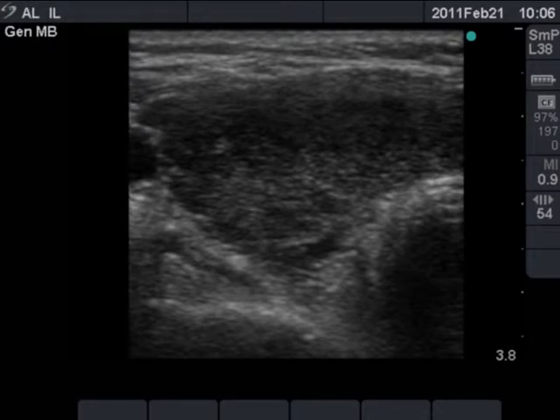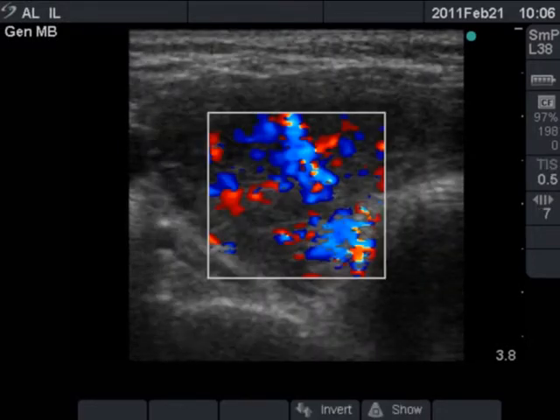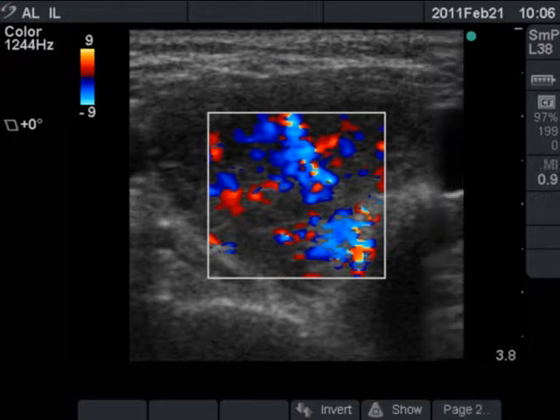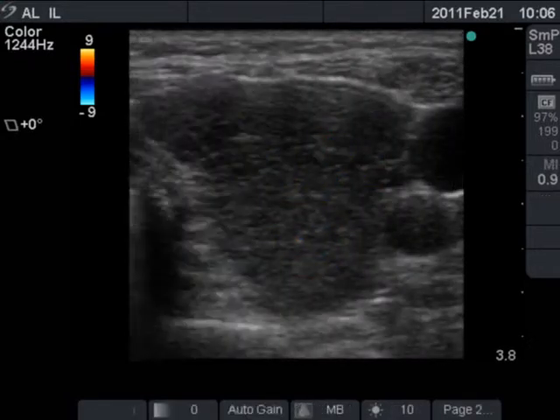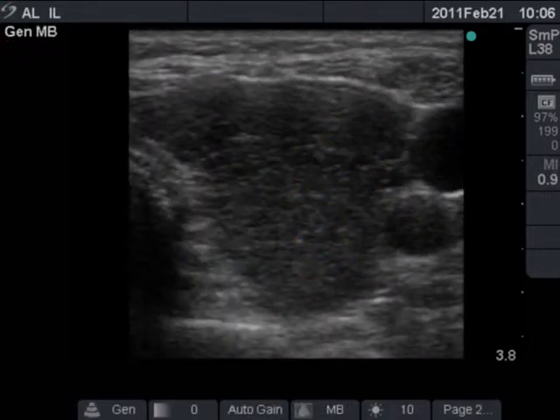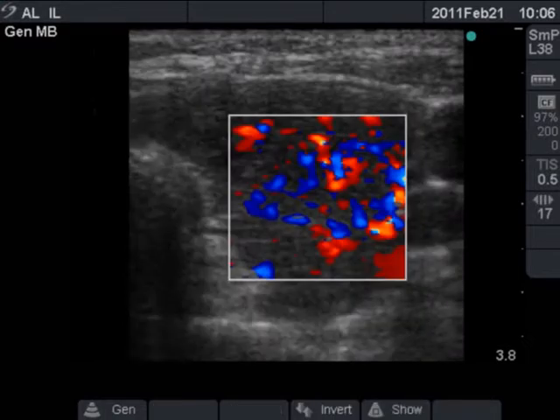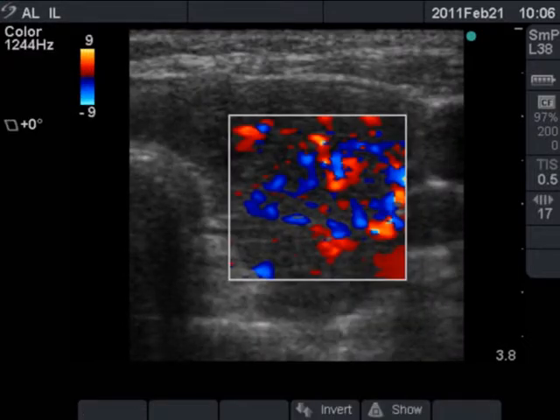The right lobe is hypoechogenic, inhomogeneous, and presents increased vascularization. The left lobe has a similar pattern, which corresponds to the hyperthyroid phase of Graves disease.